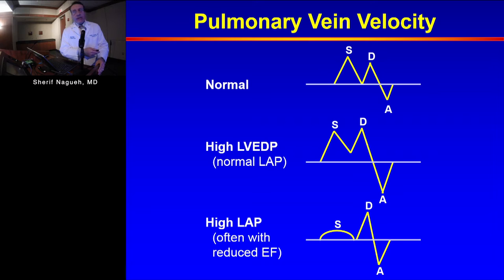In patients with diastolic dysfunction, the earliest pressure to go up is the LV end diastolic pressure. They may still have normal mean diastolic pressures. And in the presence of normal LA contraction, normal LA function, the A velocity becomes quite prominent, both in absolute value, in duration, and of course, with both being increased, the time velocity integral as well. We're looking at a velocity that exceeds 35 centimeters per second.